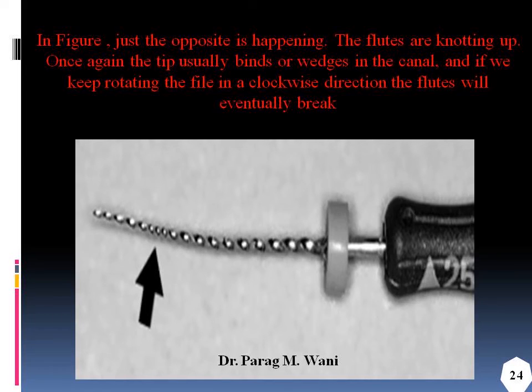On the other hand, the best part about stainless steel files is that they give you a sign to be discarded as soon as they have got distorted. It will either show a shiny spot, or unwinding, or too much twisting of the flutes. That is the time you should discard the stainless steel files.